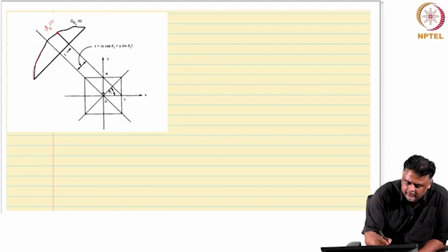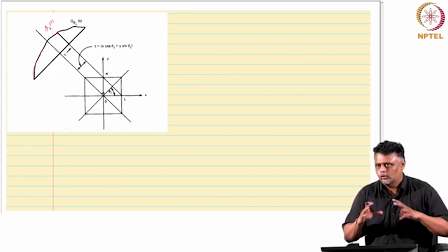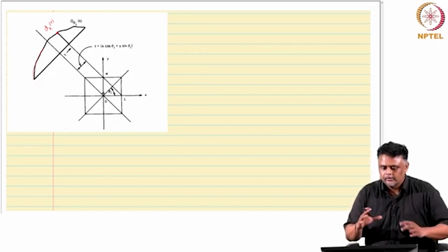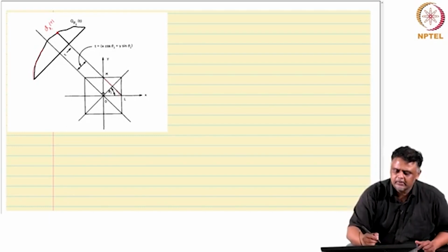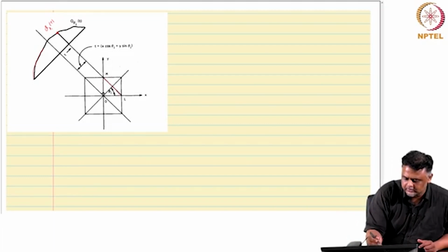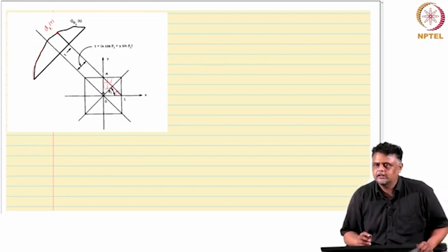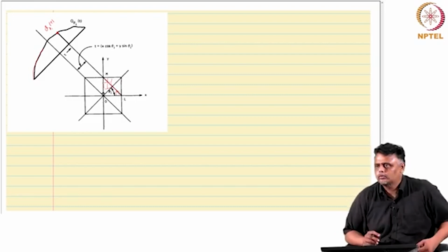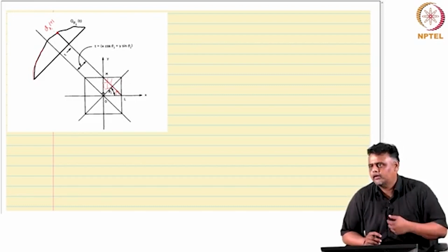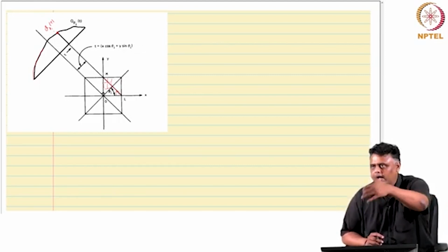Then you construct the grid. This box you see here is the image array or grid that you define, a digital array, and what you do is you take this point and smear it across the grid. What I mean by smearing is that there will be different image pixels at every point, and this line will go through different image pixels that you are trying to reconstruct. Wherever it cuts through an image pixel, you assign the same value q theta i of t to that pixel. You can do that from every angle and sum them all up.